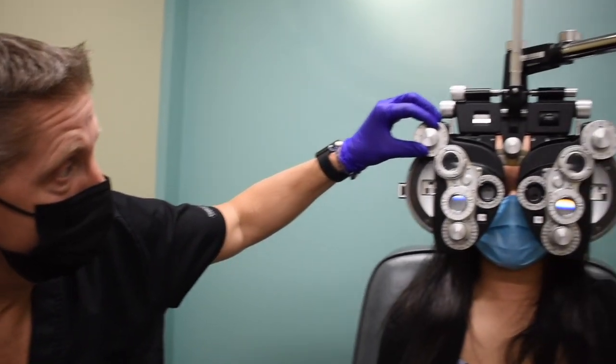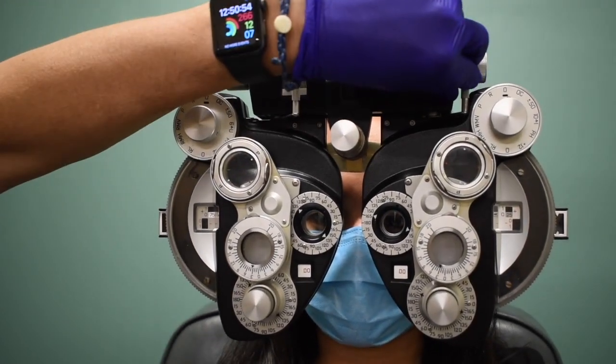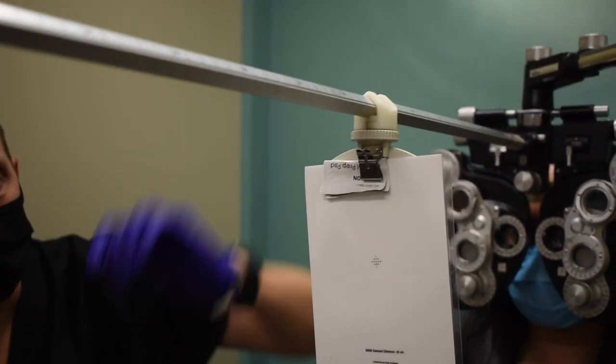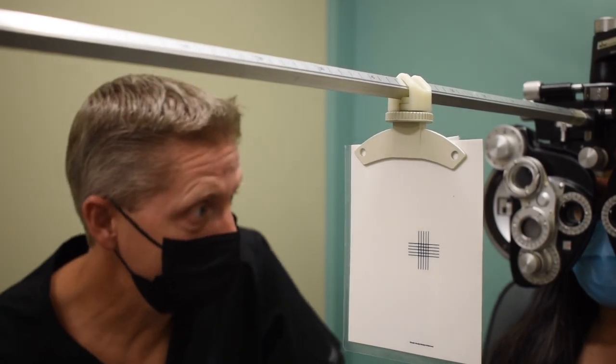If we've got a patient, we've just finished their distance refraction sequence, everything is set up here. First thing we need to do is angle the phoropter in. Second thing, we'll drop the reading rod down with a card on it, set at 40 centimeters. We have our 20/20 line of letters on here. We'll rotate this around, have the patient look right out here.